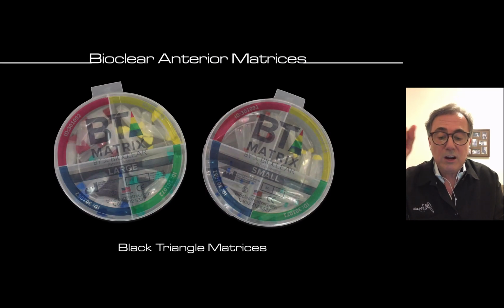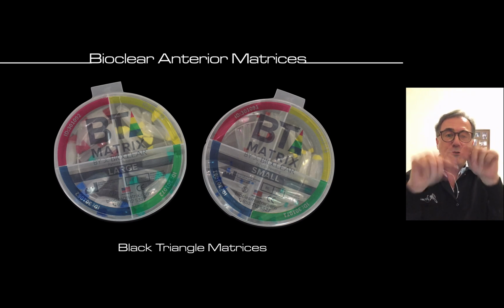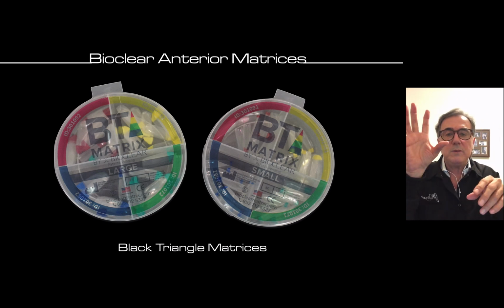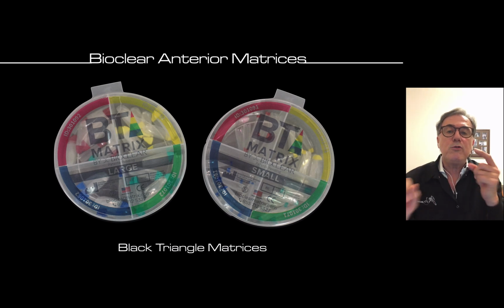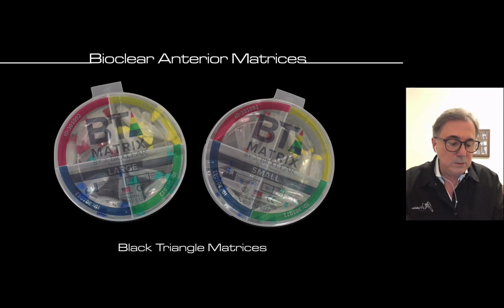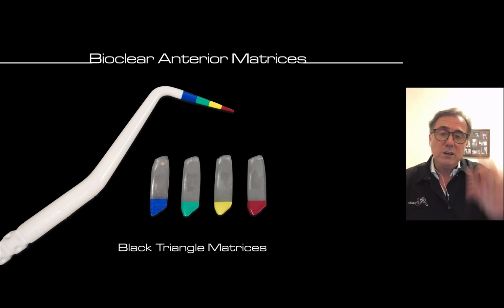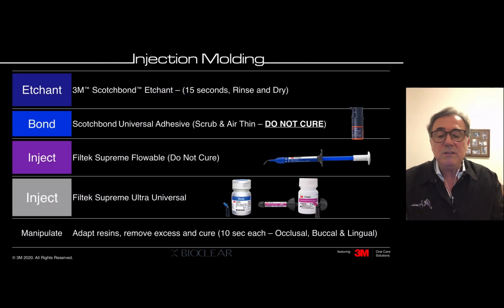Okay, so these are the black triangle matrices. They come in 2 groups, for small teeth and for large teeth, with 4 sizes in total. Mainly for upper teeth, lower teeth, but the small ones, sometimes you can use them for small laterals, upper laterals. The kit comes with those 4 sizes, and you have this probe to help you choose which one is the proper matrix for the case you're doing.